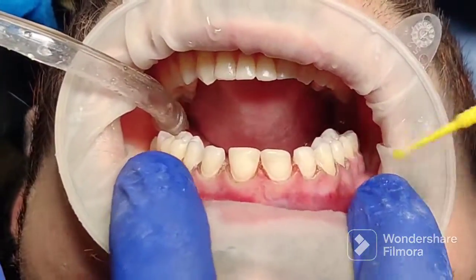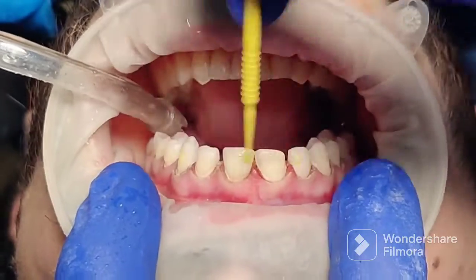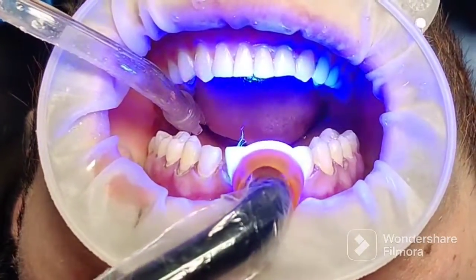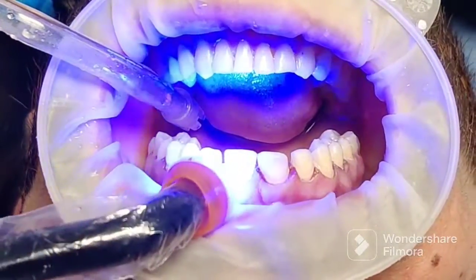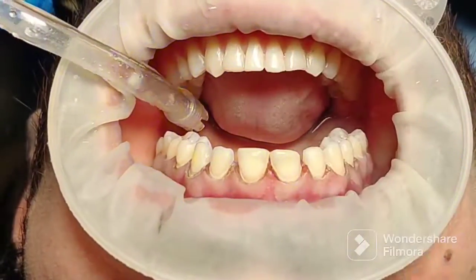Etch right in the center for 15 seconds, clean that up, and then apply bonding agent exactly in that area. Don't air dry — cure completely. We want the bonding agent to be just in the central tooth because we want these temporary veneers to come off eventually.